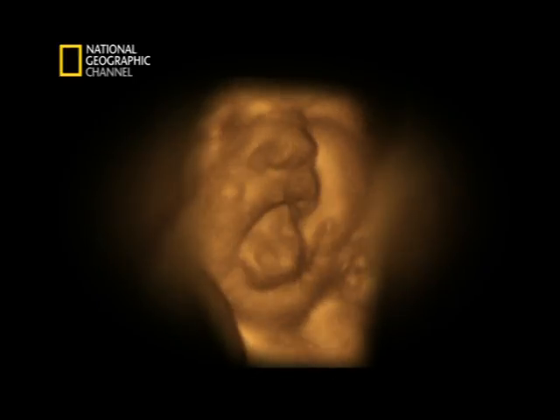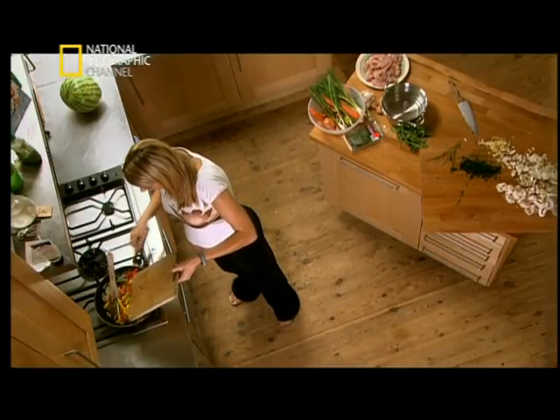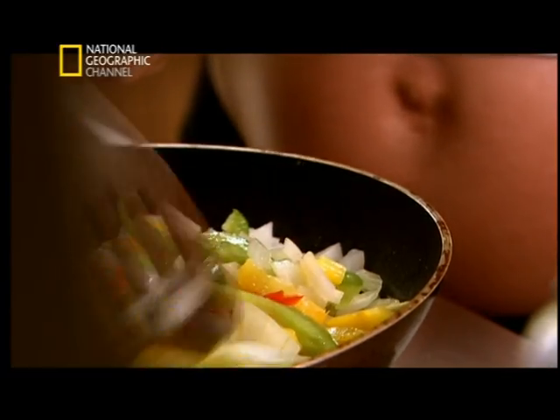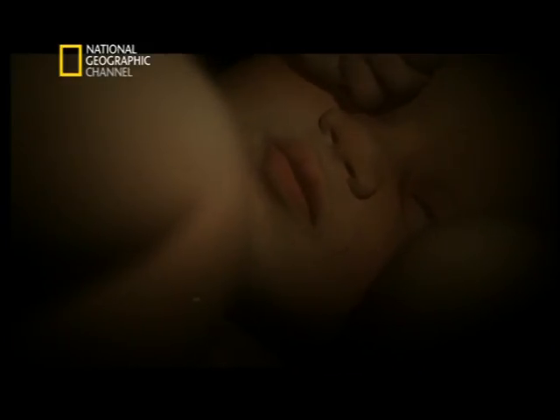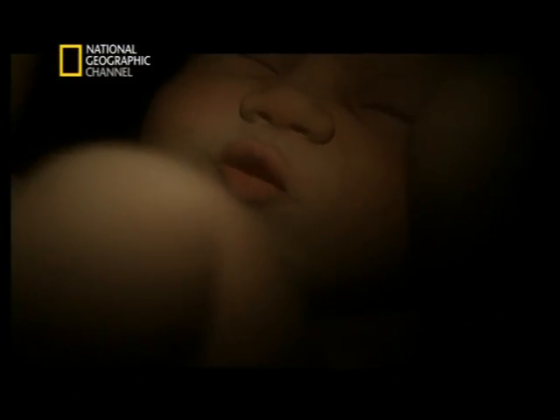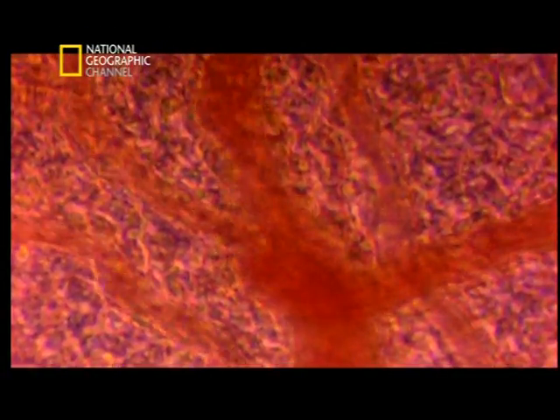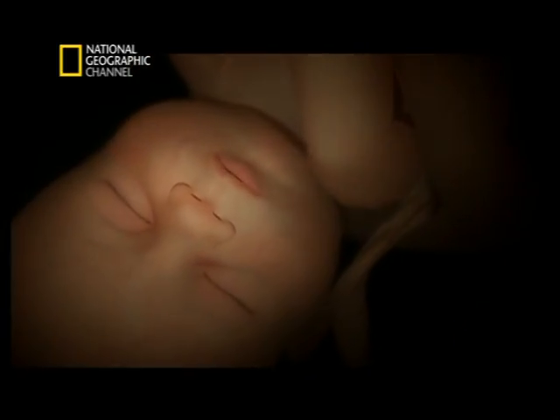In this image, we can clearly see a 24-week-old fetus sticking out her tongue. No one knows exactly why, but we do know that her mouth is full of taste buds. She could be tasting the amniotic fluid. A fetus's mouth and nose are permanently filled with amniotic fluid that we know can carry the tastes and smells of the mother's food. Strong flavours will easily pass through the placenta into the baby's bloodstream and will eventually be passed out into the amniotic fluid, and the baby can get an early taste of her mother's cooking.